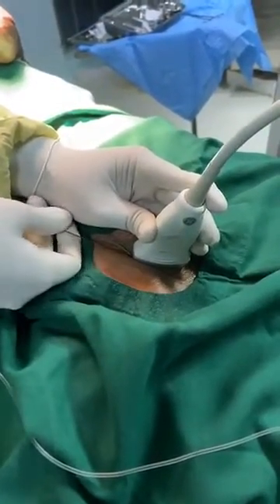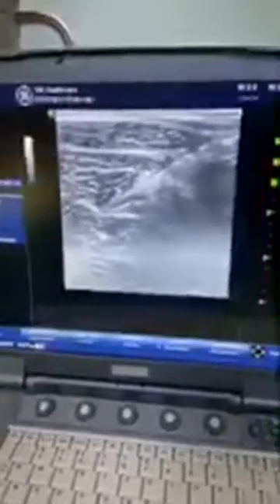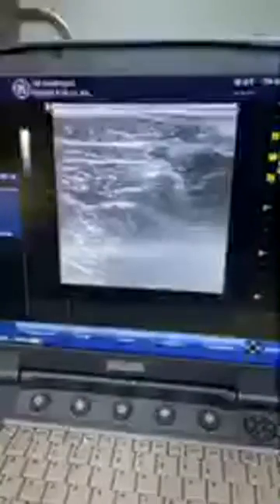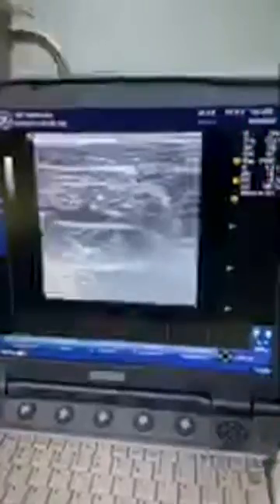Here you can see the needle on the screen, coming in-plane. I am going first for the posterior division. You can see I am advancing the needle between the adductor brevis and magnus muscle. I will start injecting the drug and it is nicely spreading in the plane between brevis and magnus. I will inject 10 ml of LA here to block the posterior division of the obturator nerve.